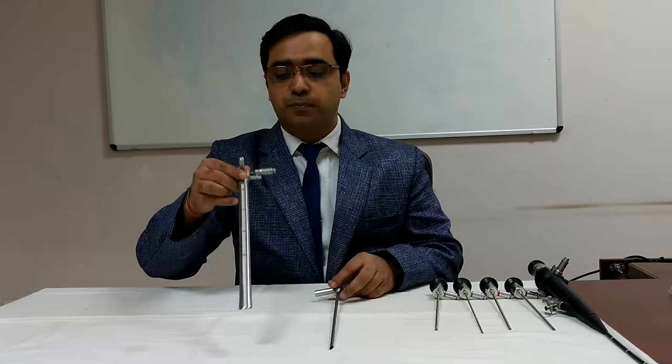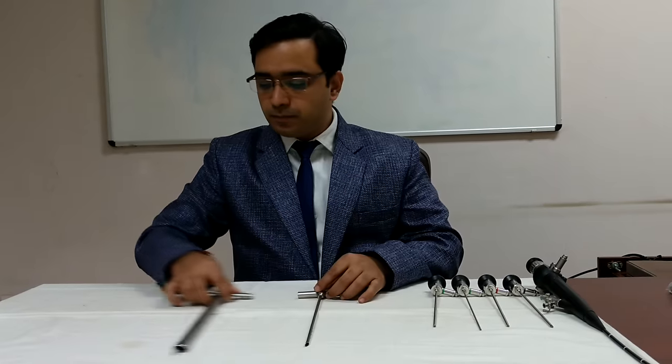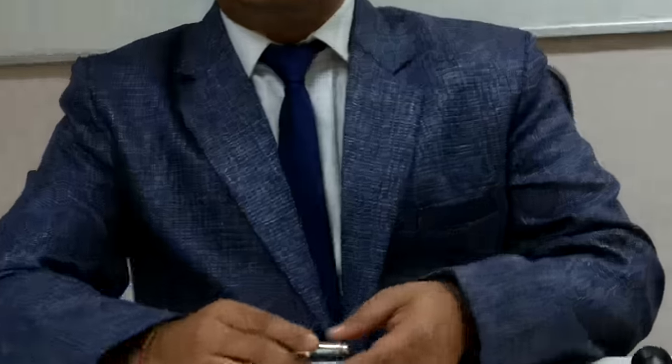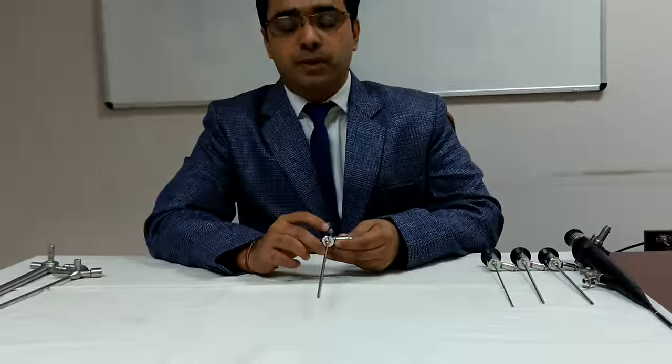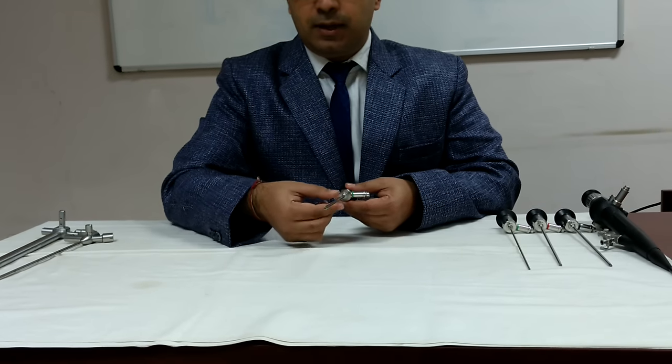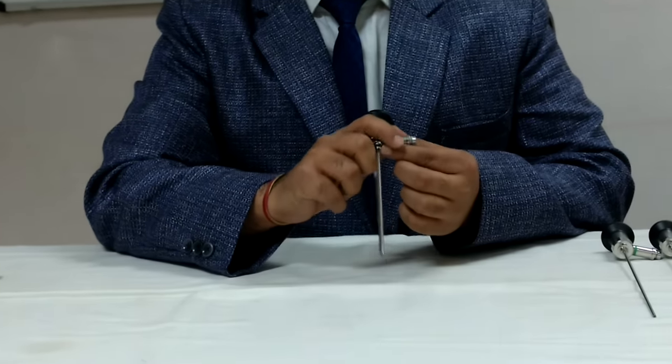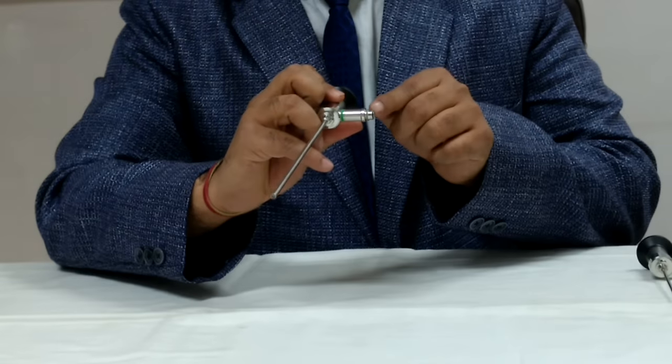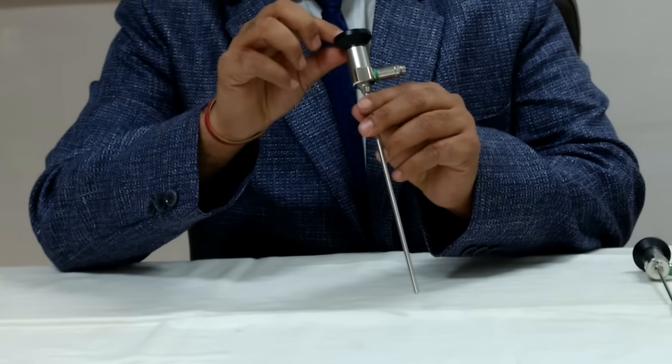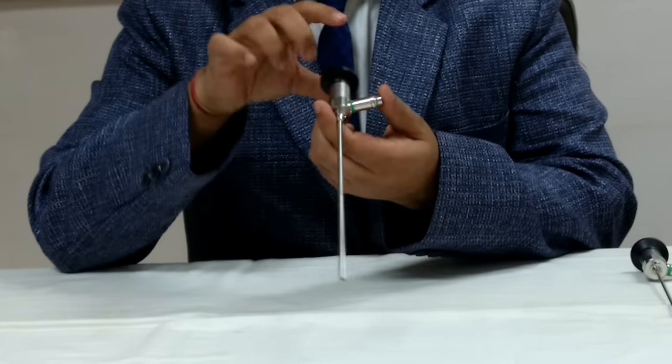So this is esophagoscope, bronchoscope. Another important scope I should tell you is nasal endoscope. This is adult nasal endoscope. This is the part which goes into the nose. This is what we hold in our hand. This is for light carrier. This is eyepiece from where we look or from where we attach camera.